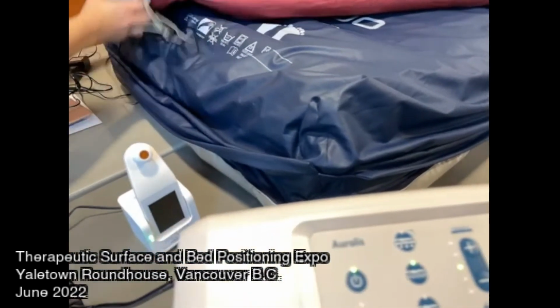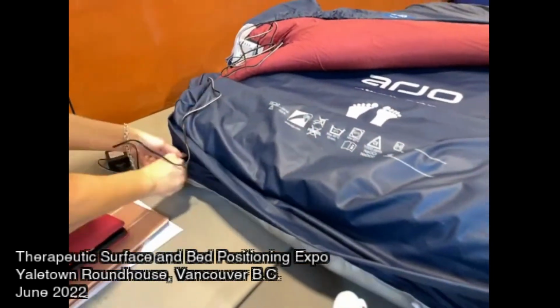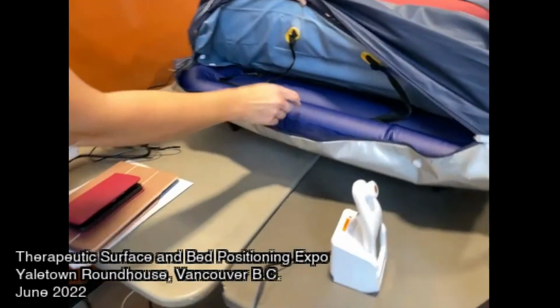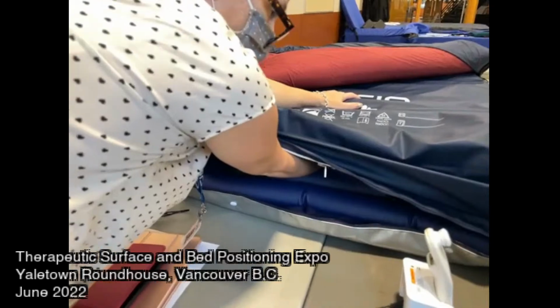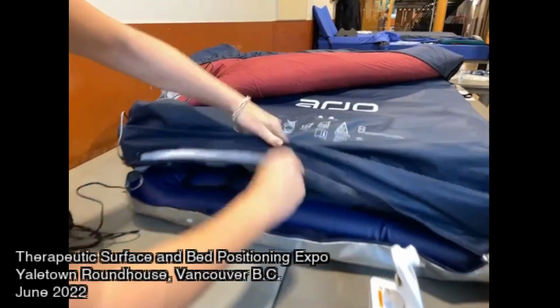There are a few zippers because there are a few layers. Start here. It's the very bottom layer. So this is a sub-layer, a layer underneath the top cells. What are the top cells? I'm going to show you those in another compartment.